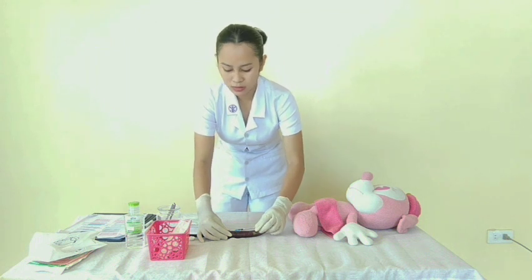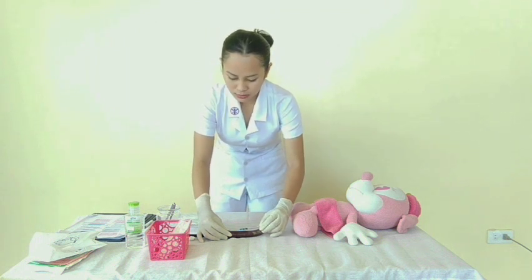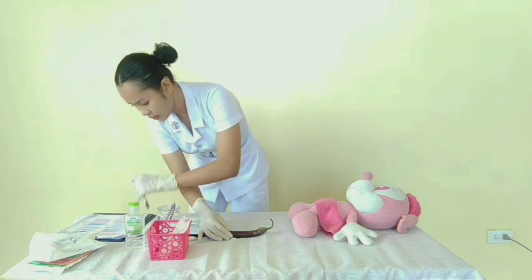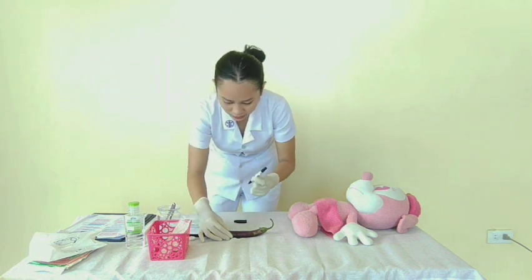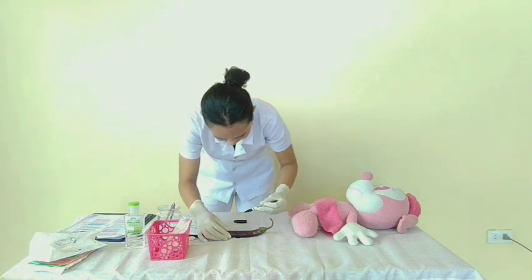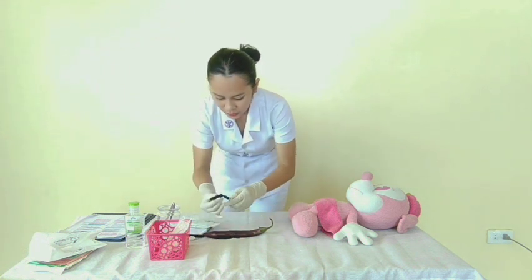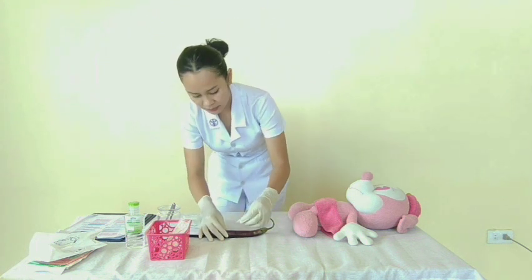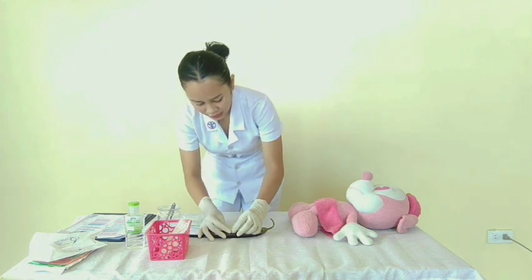Now withdraw the needle quickly at the same angle at which it was inserted. Then discard the syringe and draw a mark around the injected area. And now apply a cotton ball on the injected area. Do not massage the area that was injected.